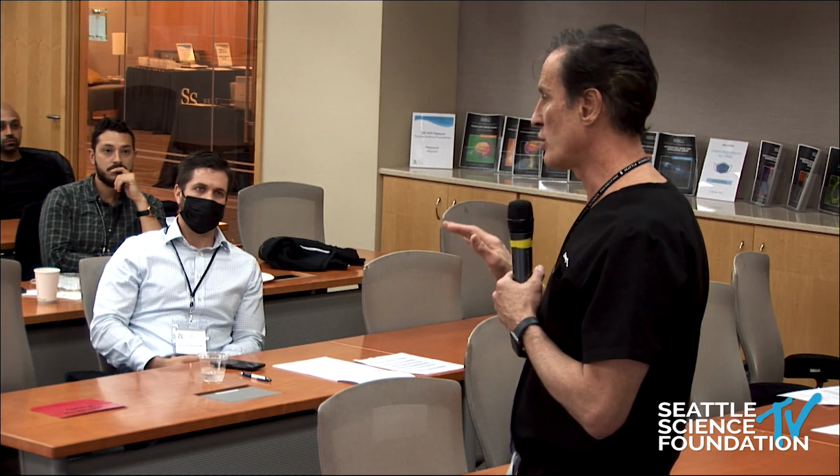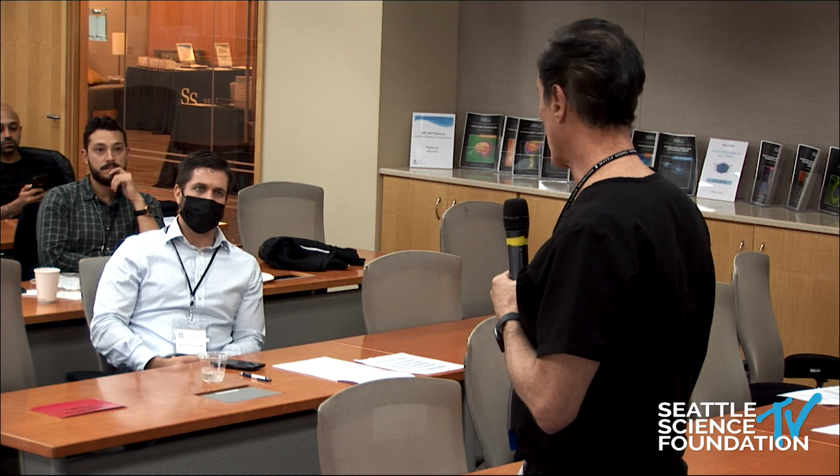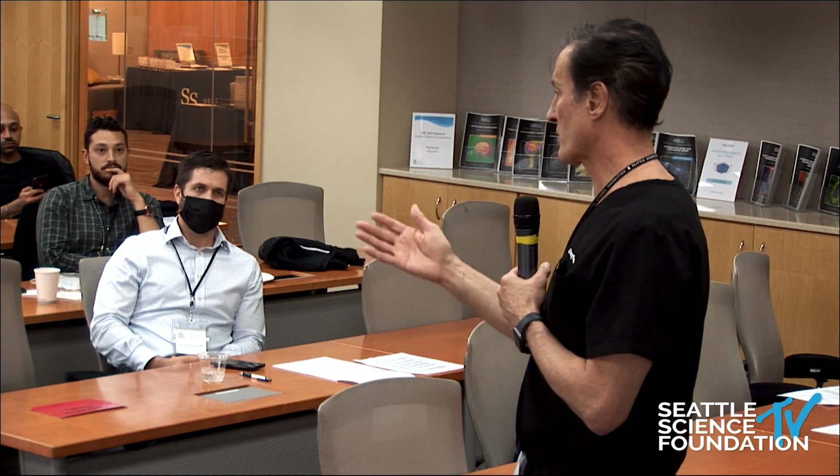So it's just the knowledge about where your boundaries are, why you're doing what you're doing, and how to approach each specific patient like that. And that's the reason why we get so weirded out about the word retropulsion, because people use that. This patient has retropulsion. Well, what does that mean? It doesn't mean anything to me. I mean, are they neurologically okay? If they're yes, go. If they're not, that's a relative contraindication.